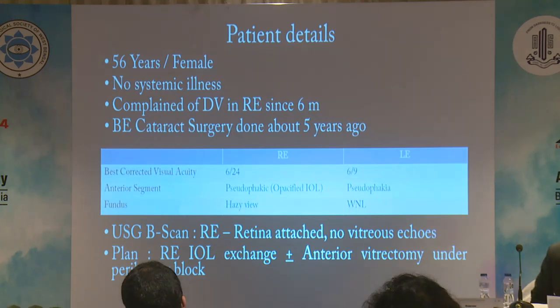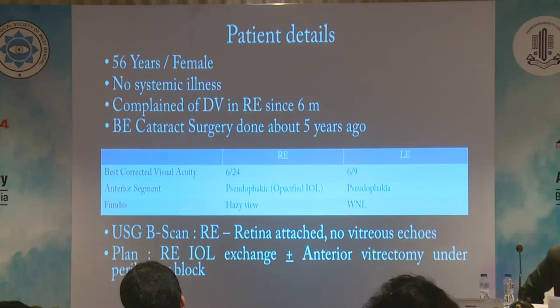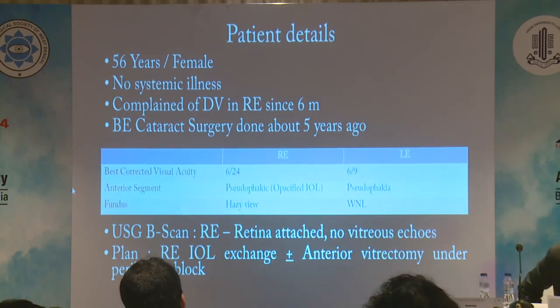Anterior segment examination showed both eye pseudophakia with an opacified IOL in the right eye. The right eye fundus was hazy and the left eye fundus was within normal limits. Right eye ultrasonography B scan showed the retina to be attached with no vitreous echoes. So I planned to do an IOL exchange plus or minus anterior vitrectomy under peribulbar block in this case.